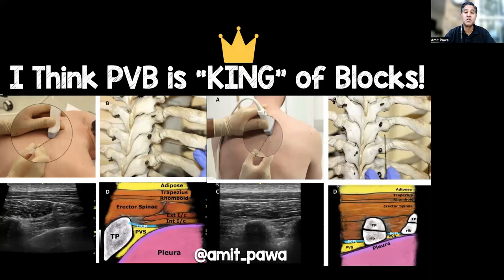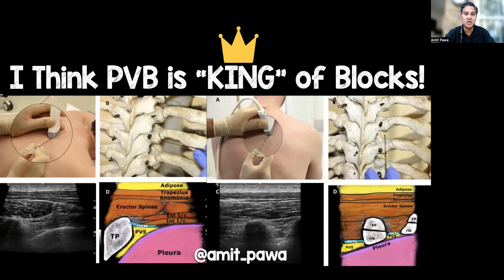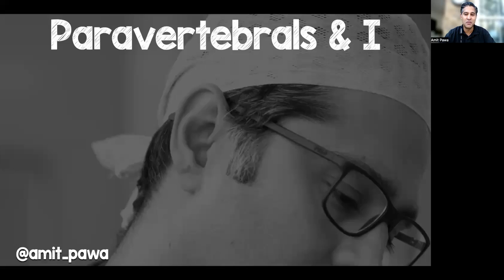It will come as no surprise to you — I think the paravertebral block is the king of blocks, and I'm hoping that you will feel the same way too.